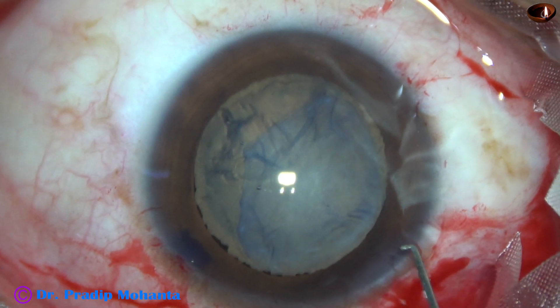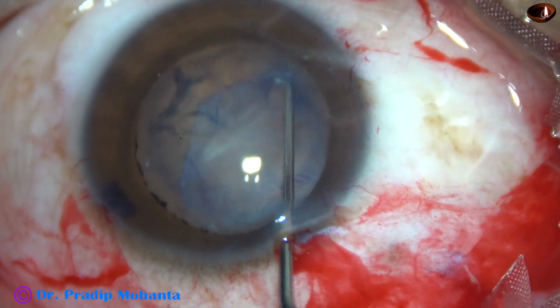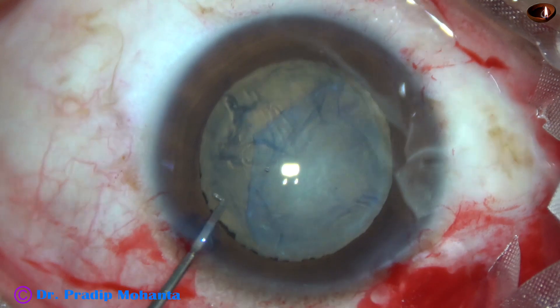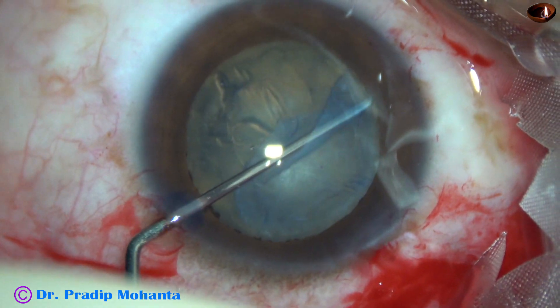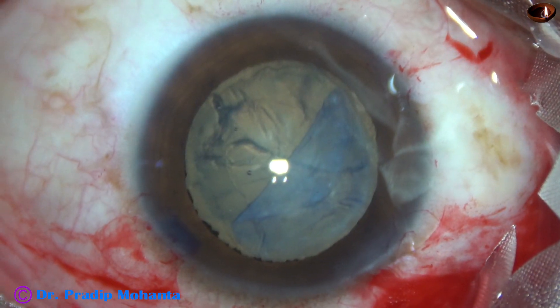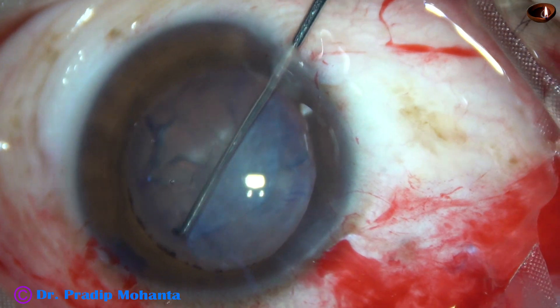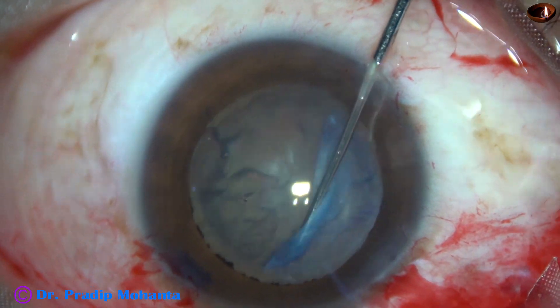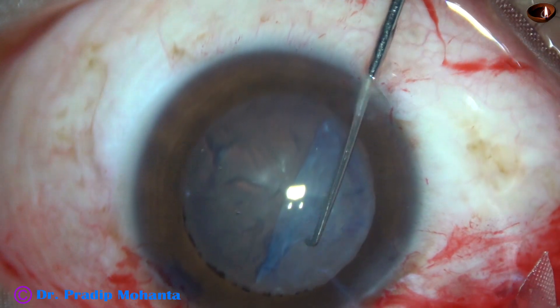Here I'm planning to go beyond the fibrous sheet and pull it back, but I could not do this. The fibrous sheet has folded and it has become very tough now to separate it from the anterior capsule.